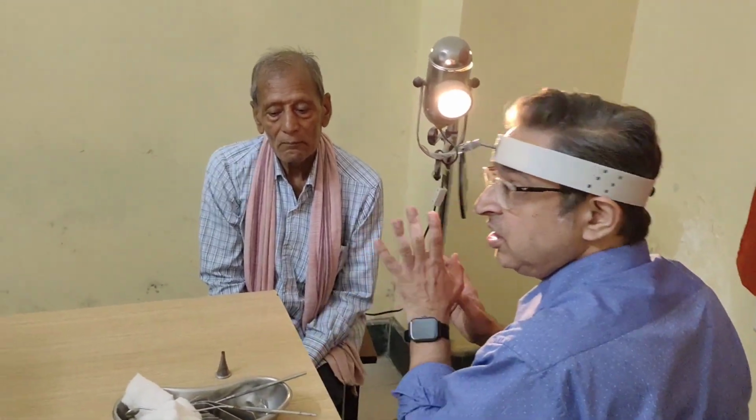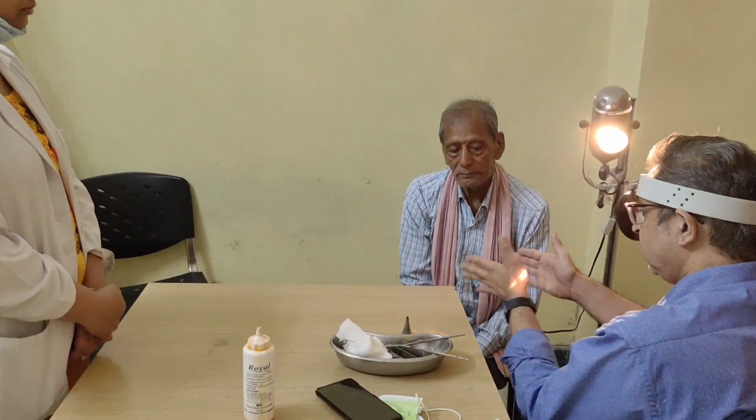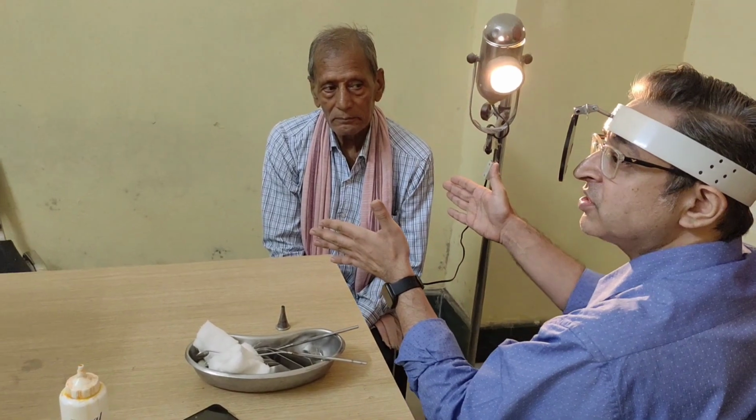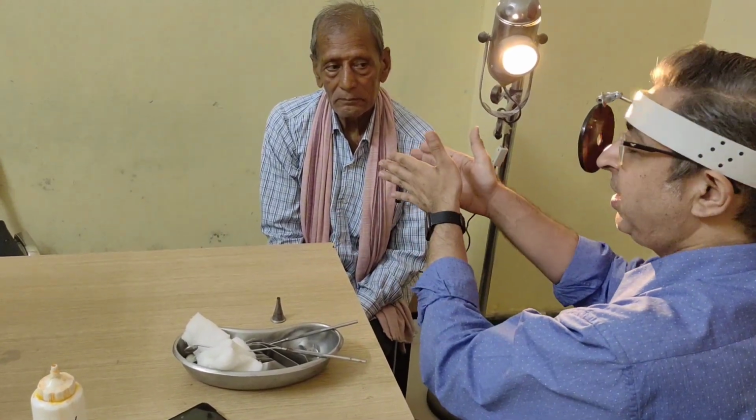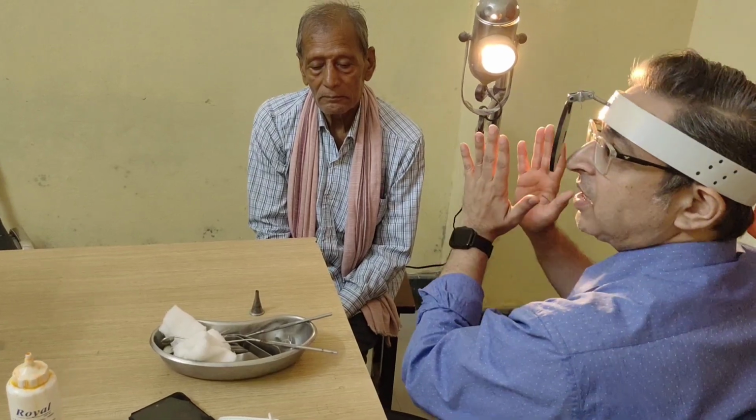Then you use the ear speculum. There are various ear speculums like Toynbee's ear speculum, which is slotted. You've got a Hartmann's ear speculum. You've got Politzer ear speculum. There are various ear speculums, but the function of the ear speculum is to straighten the canal, hold back the hairs, so that you can get a better view inside. Without speculum examination, with speculum examination.